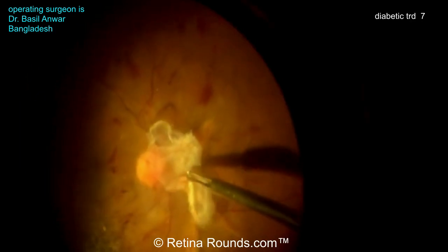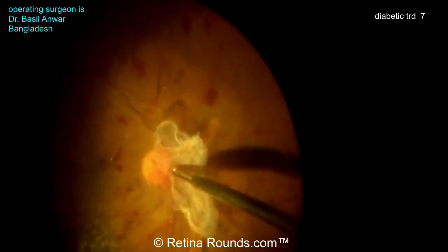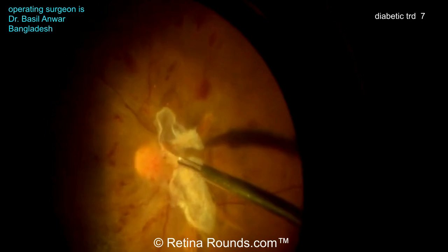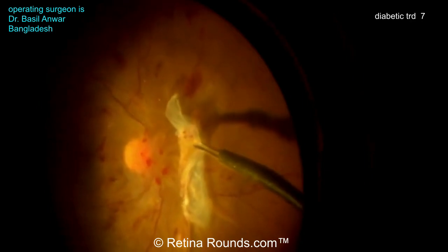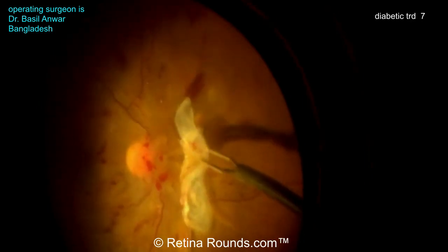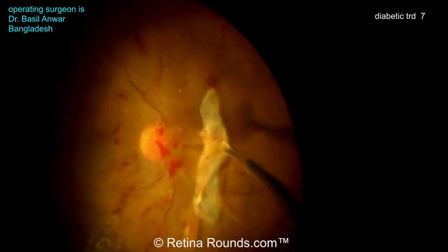Now he's using forceps to lift up that membrane. You want to be really careful here, and he's doing a great job of just carefully lifting up these membranes, not exerting too much traction on the underlying retina. Now lifting up at the optic nerve — this is generally a very good way to make sure you're in the right plane. The downside is that if you do get bleeders over the optic nerve, it's not something that you can cauterize. You'd have to stop bleeding with tamponade pressure, which in these ischemic cases is not ideal.